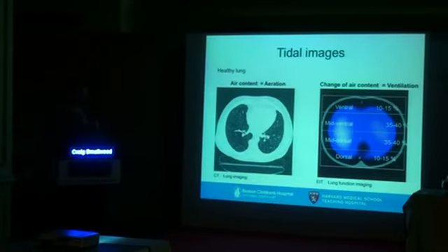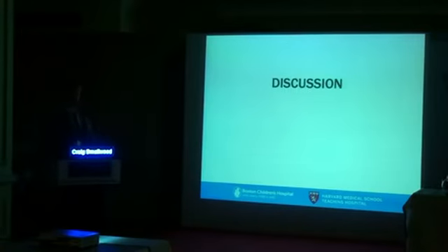If we can maintain good ventilation-perfusion matching, then we can hypothetically optimize our care and gas exchange, and then get away with reducing ventilatory settings even a little bit further. So that's the general goal. Obviously here most of the ventilation is in the mid portions of the lung, but I hope to show you this morning and convince you that areas 3 and 4 are probably the most clinically important at this point, but I'll leave that for now. So thank you very much.